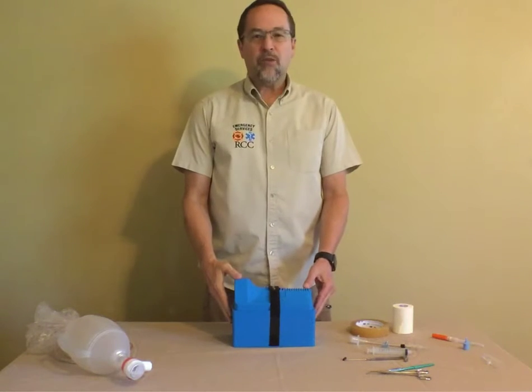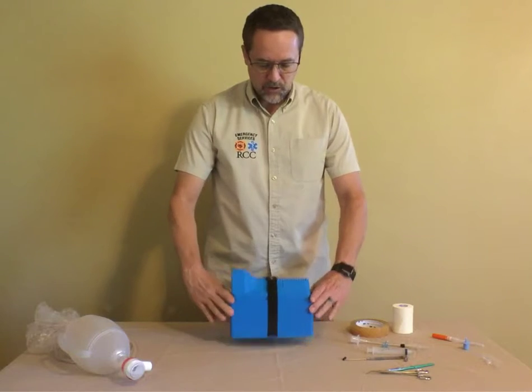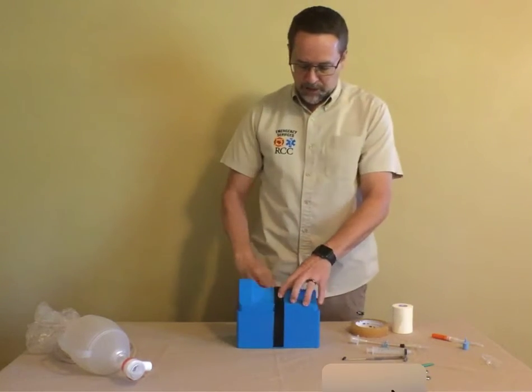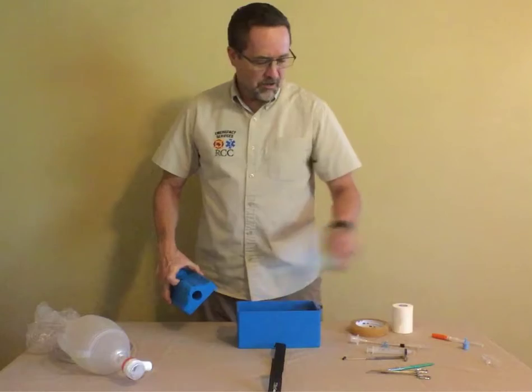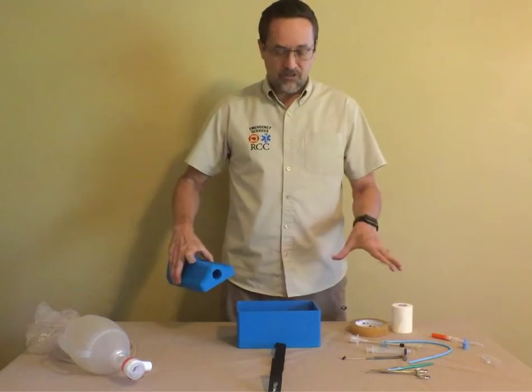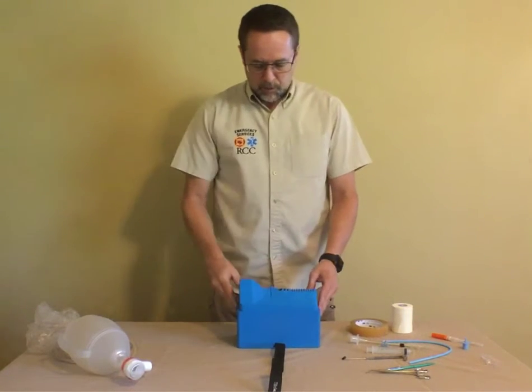This is the cricothyroidomy training prop. Just want to show you a couple things about how we use it. This is a 3D printed prop that also works as a storage box. It has a strap to keep everything secure, and the lid and the box itself actually stores all of the equipment that we will use for both needle and surgical cricothyroidomy. And it becomes the base that you can use for your training purposes.